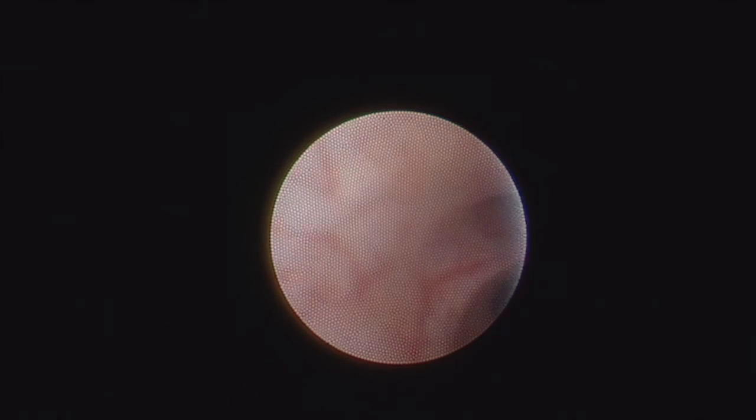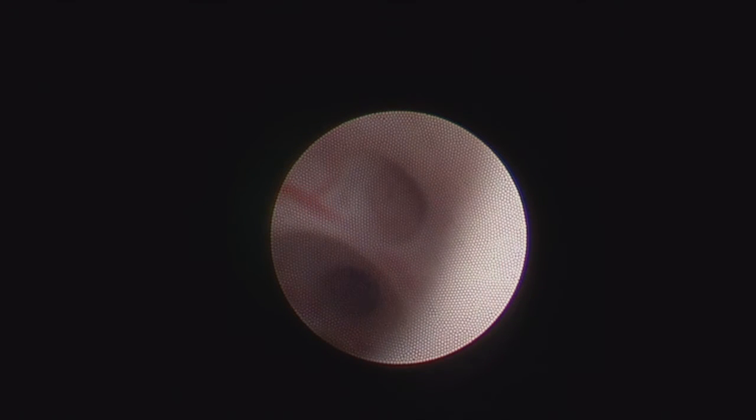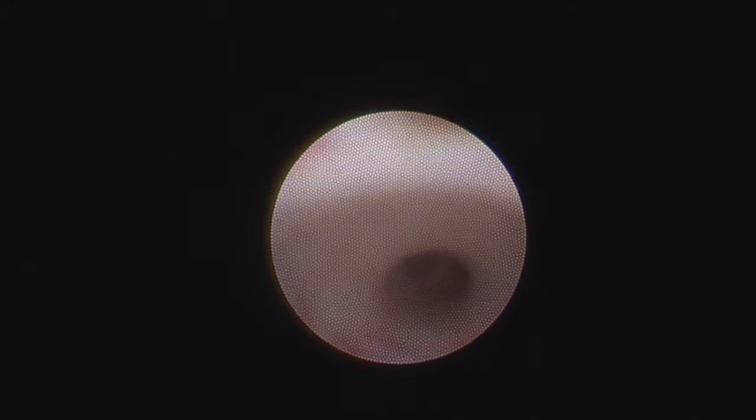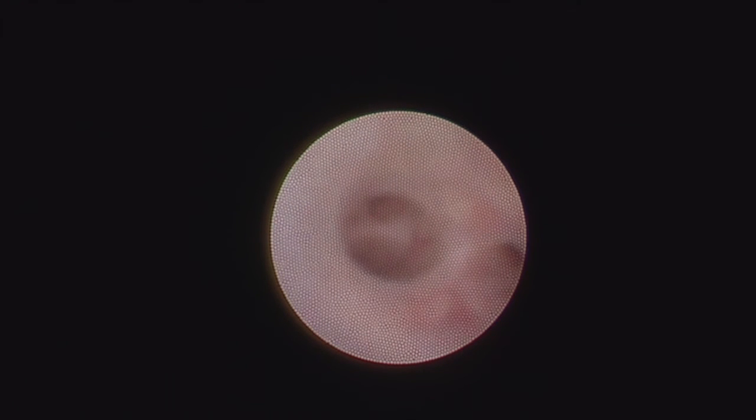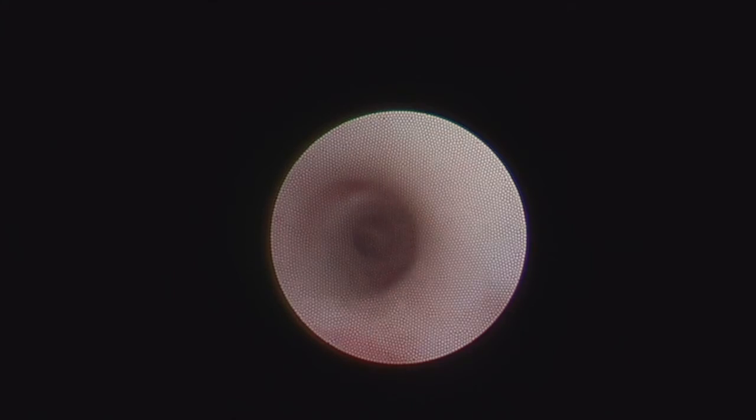The course of the duct should be examined for any strictures, sludge, or thickened secretions, and irrigation should be ongoing during the procedure. My recommendation is that you use the largest sialendoscope that you think you'll be able to place into the duct. Some people think that the 0.89 mm sialendoscope will be easier to use because it's the smallest; however, I find that visualization is limited with the smaller scopes. Therefore, a 1.1 or 1.3 mm sialendoscope for a diagnostic sialendoscopy is my preference. Displayed here is a relatively normal parotid duct, and as you get closer to the end, you start to see the branches of the parotid duct. There are no stones and not a particularly high burden of sludge in this case.